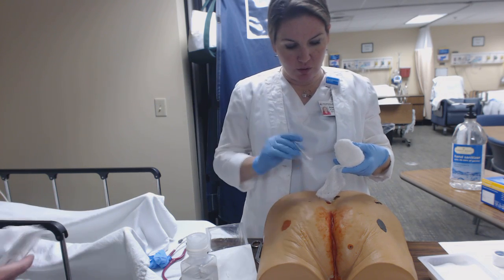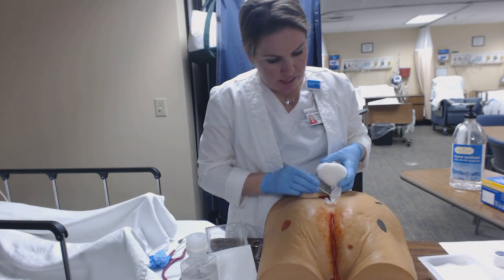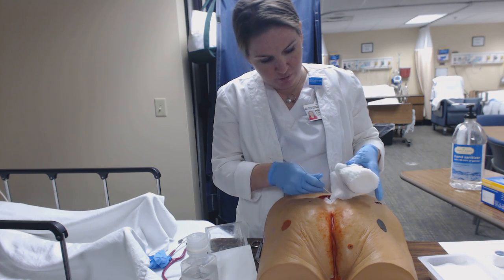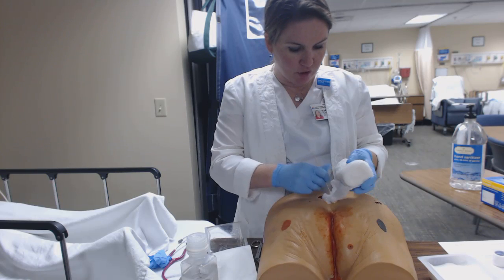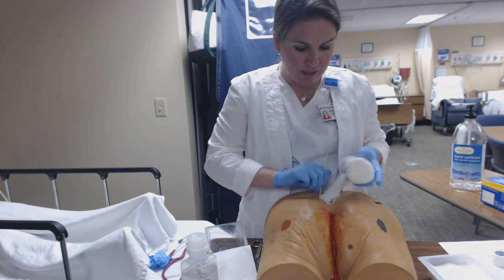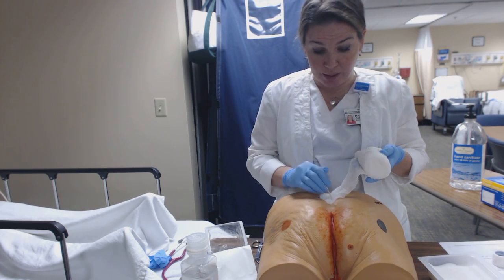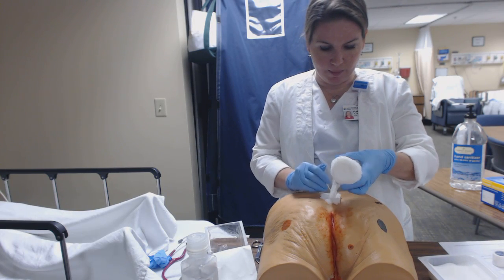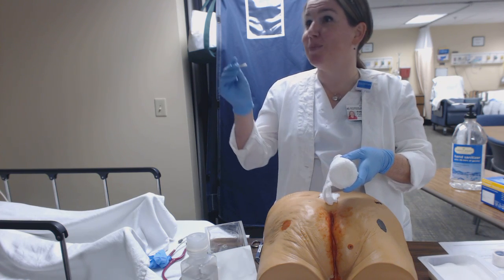Thank you. So this is going to help me get to those areas underneath the skin that we can't completely visualize and be able to have the dressing adhere to the tissue there. Because what we're doing with a wet to dry dressing is our goal is mechanical debridement generally. So what we're going to do is we want to get in contact with all of the tissues there. So I did break this.